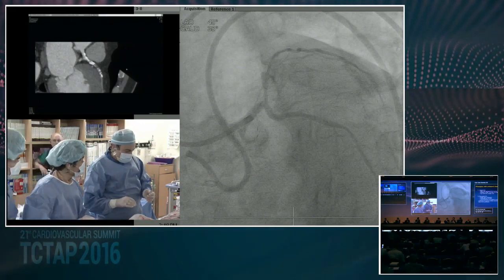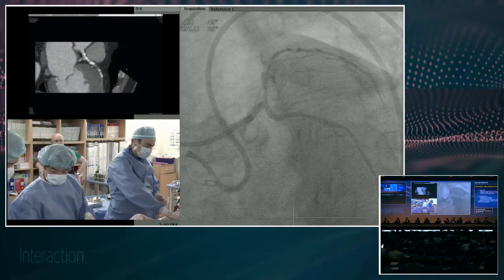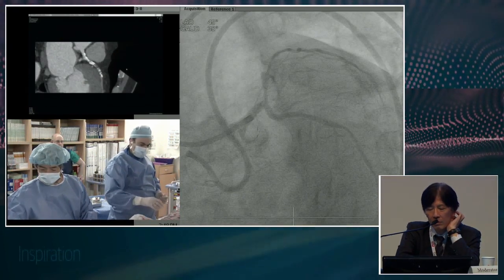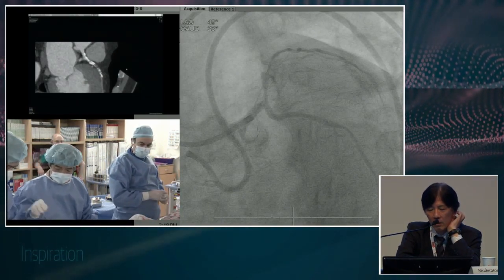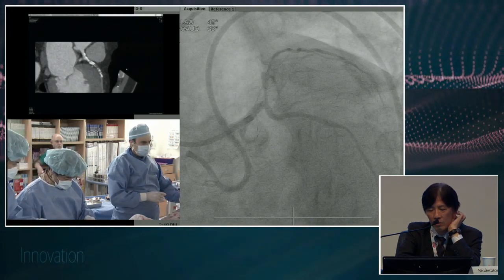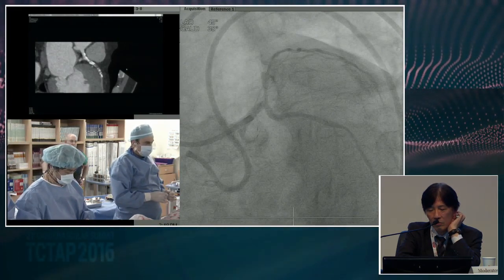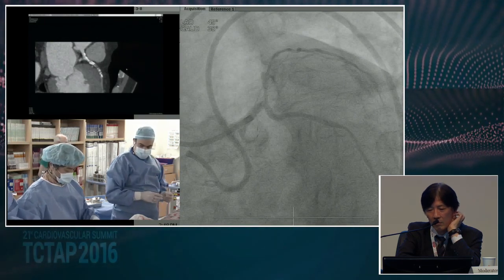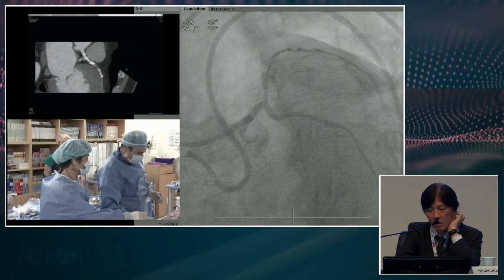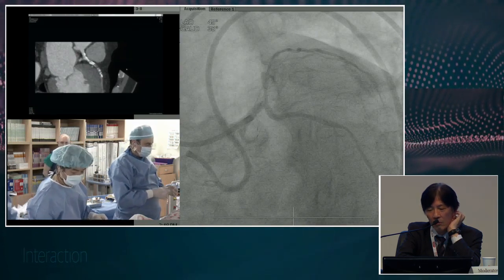I think this is very difficult for the retrograde because, as you suggested, the right coronary is very tortuous. And if you use the microcatheter deep into the right coronary, the tortuosity makes it weak, and worse for the guidewire manipulation. So first of all, consider how to stretch the right coronary vessel because, for example, the Corsair is nice because it stretches the vessel a little bit and makes guidewire manipulation into the collateral channels easier.